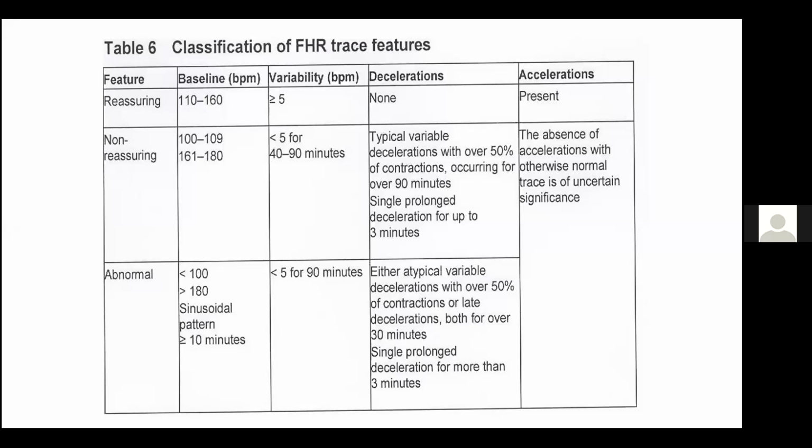In 2 hours, you need to identify what was causing this non-reassuring sign. We're going to discuss that. So it could have been just dehydration. Just by putting up a drip and infusing fluid, it may have been just maternal dehydration that was causing the tachycardia. Or maybe it could have been a patient who was doing a VBAC and the scar is starting to dehisce. Therefore, you're going to get a fetal tachycardia.